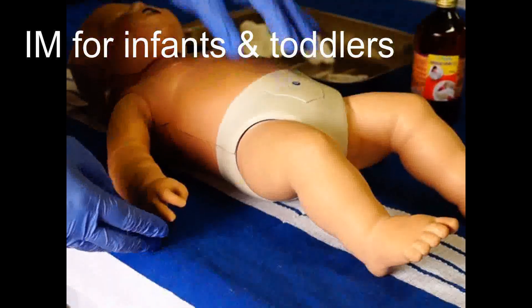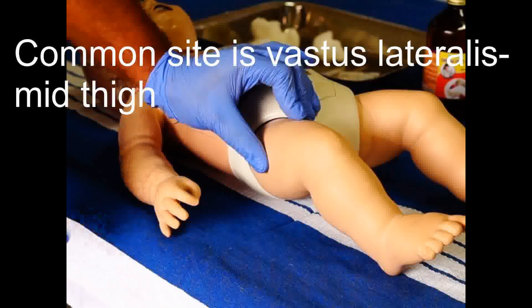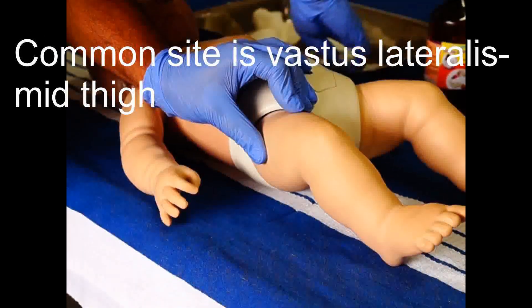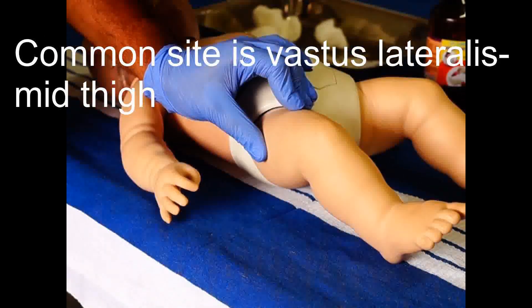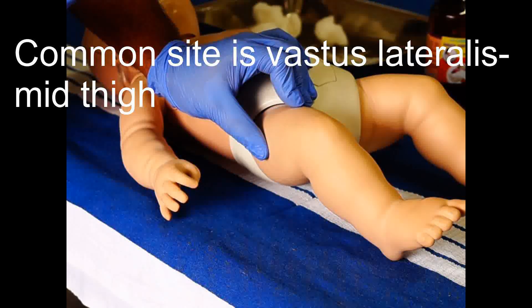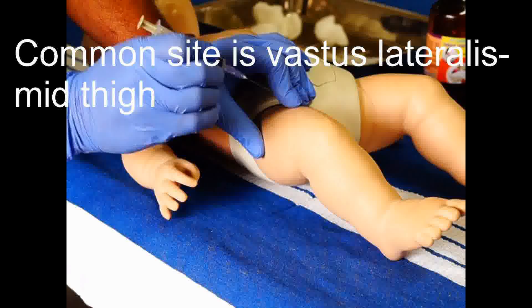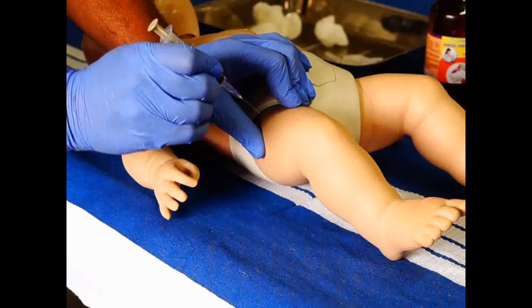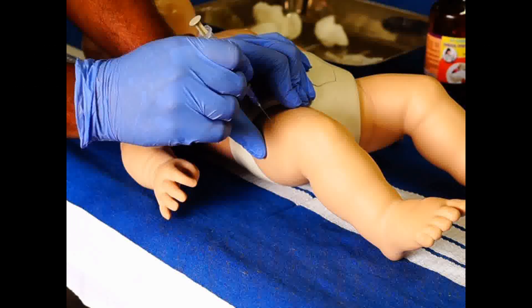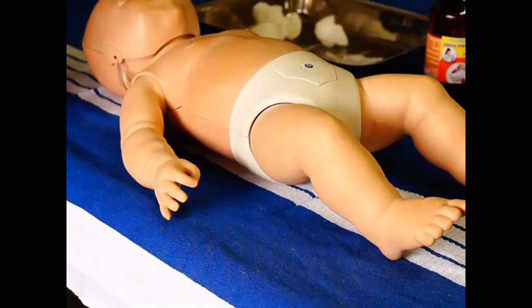For intramuscular injections in infants and toddlers, the often chosen site is the mid-thigh, specifically the vastus lateralis muscle. The procedure is similar to that for adults — hold the needle like a dart and inject at a 90-degree angle.